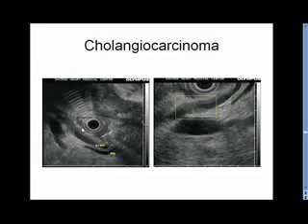This is a patient who had a cholangiocarcinoma, which you can see here as bile duct thickening. Here you see a normal distal common bile duct and a normal pancreatic duct converging towards the level of the papilla. And here is a thickening and a hypoechoic tumor, shown here in this insert one more time, and we see that quite nicely.